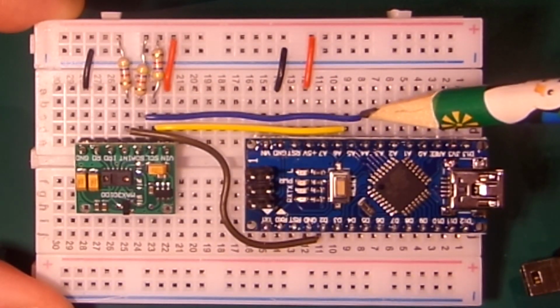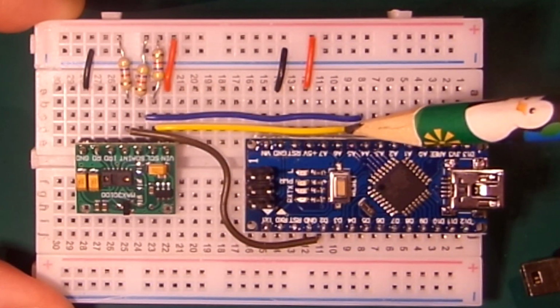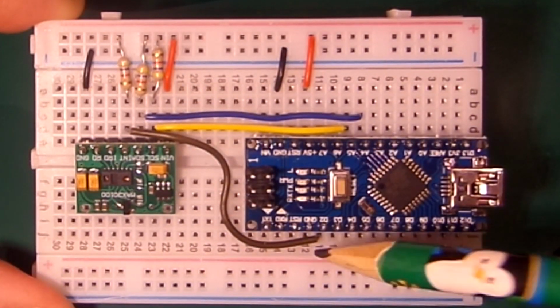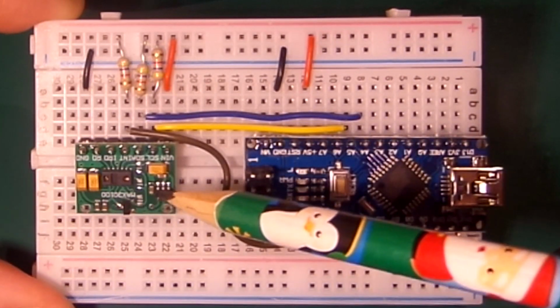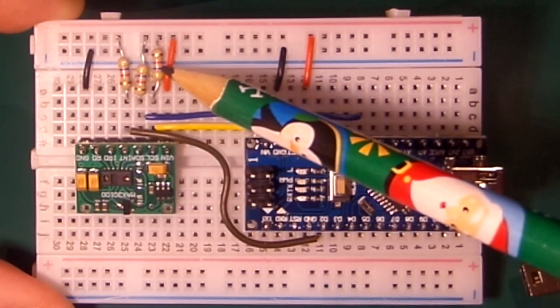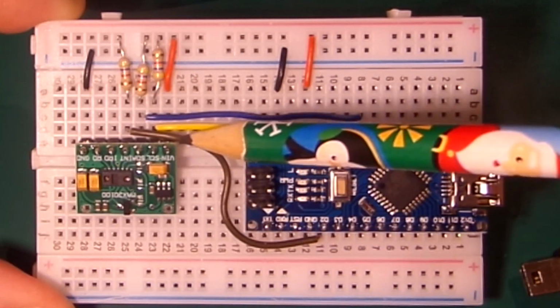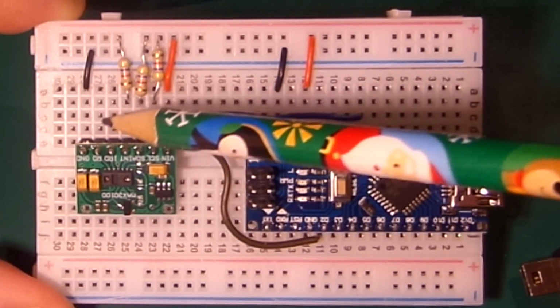We then have the normal I2C connections. On the Arduino, the data is on A4, so that's gone to the SDA connection, and the clock is on A5, and that's gone to the clock connection. We then have an INT connection, which goes down to D2. This is a requirement of the driver library and of this device as well. Now, as you remember, we took off those 4K7 resistors, and we've replaced them with 3 4K7 resistors there. I've got one connected to the data, to the clock, and to the D2 line, this INT connection here. Notice these two connections, you can just leave them unconnected.